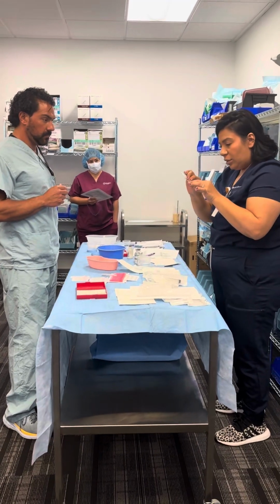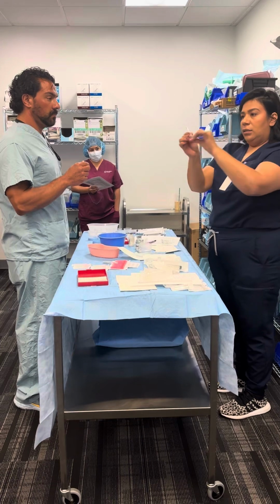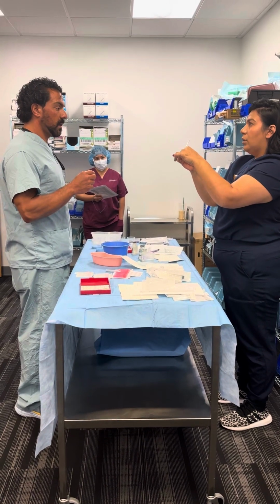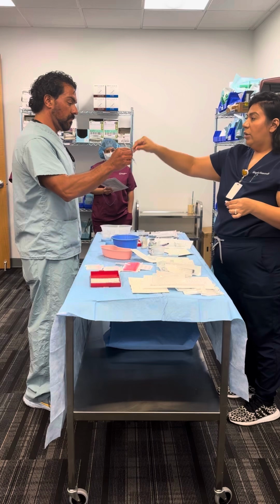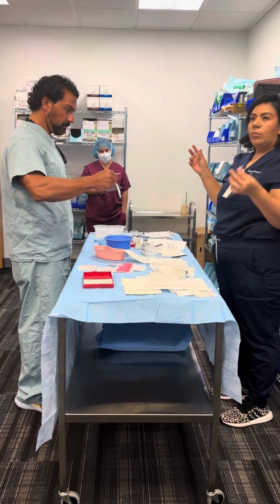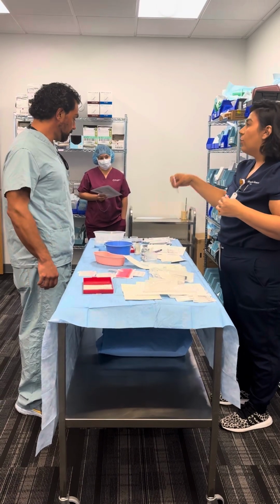It's a little bit easier for me to do this right here. Okay, so. Left hand on the, what is this called? The cap. You're gonna take it off. I have lidocaine. You're gonna pass that. He's going to inject. Oh, I forgot the most important part. Check how much. So I already said that. Okay, so you're starting with 0.9.